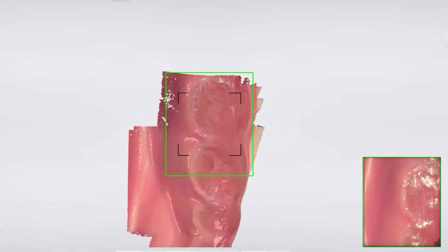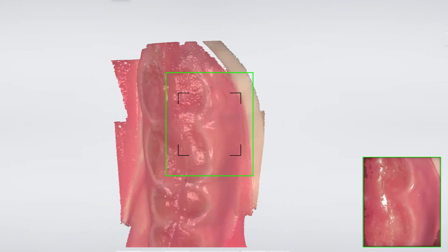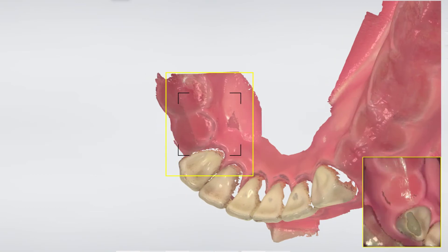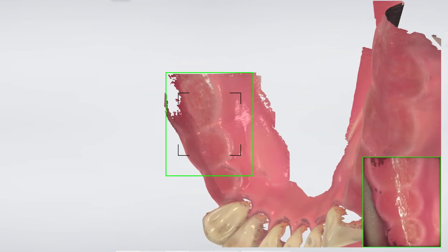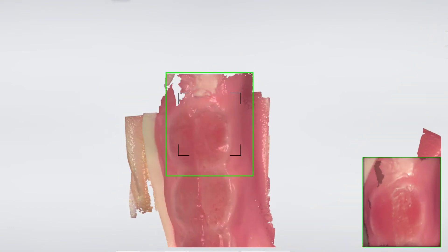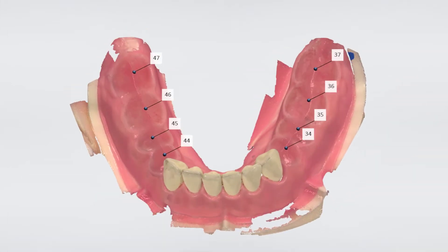because the guide will later rest directly on the crest and get support from it. Use the shape and the volume of the crest, riding from lingual to buccal, scanning the area we need. The same principle applies for all the edentulous areas. Do not trim away as much as you normally would, but keep as much of the soft tissue as possible.